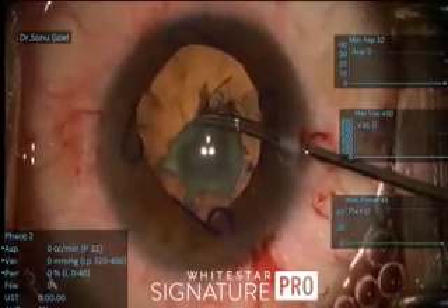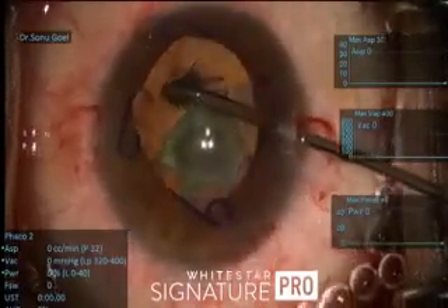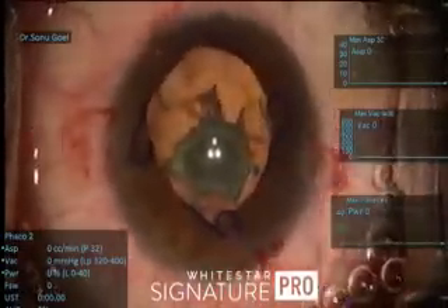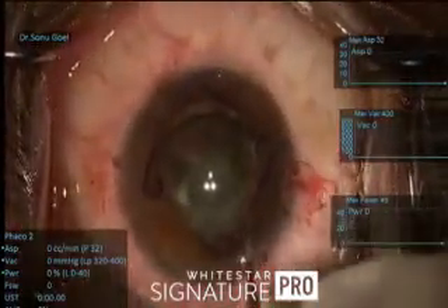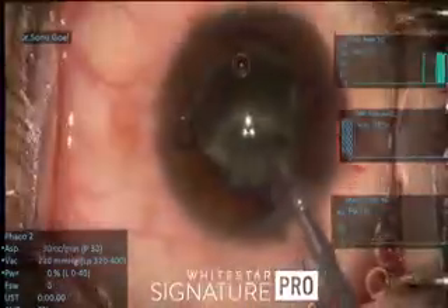When the pupil tends to extend I am very careful. A good hydro-delineation is what is required here — not a full hydrodissection — because I want to just separate the nuclear layers. This is how the nuclear matter is approached.